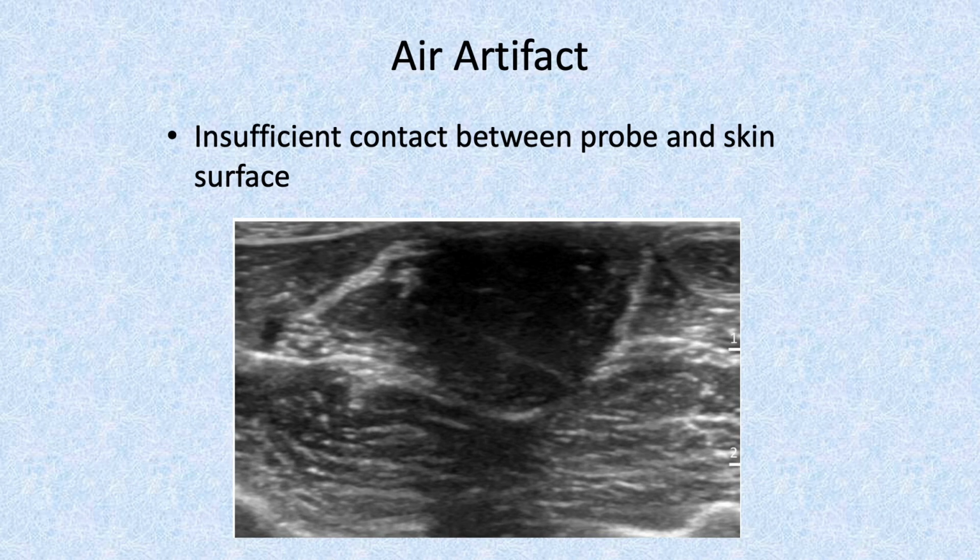Air artifact. Sometimes when you didn't put enough gel, or when you cover your probe, there's an air bubble inside there, then you will see something like this, a very dark area.